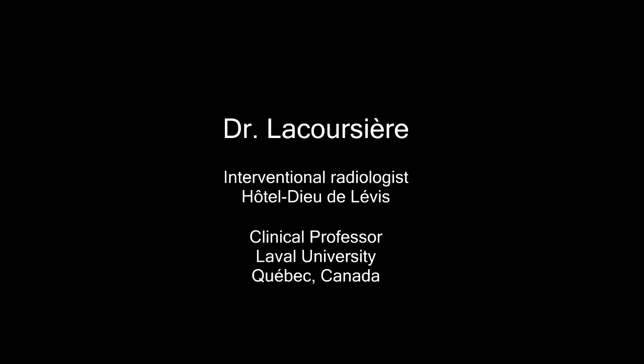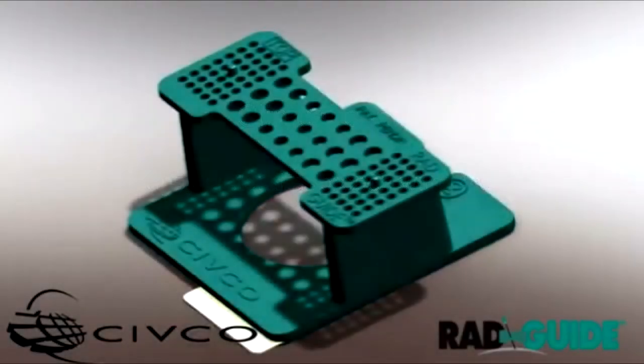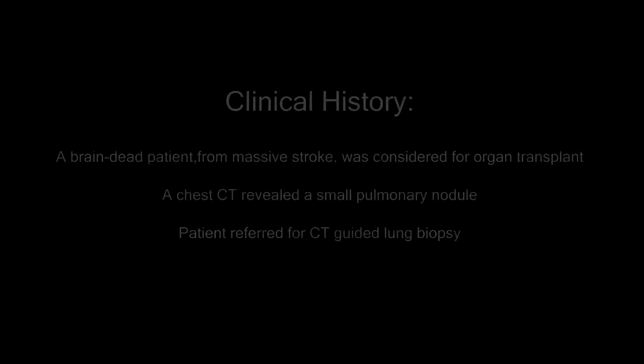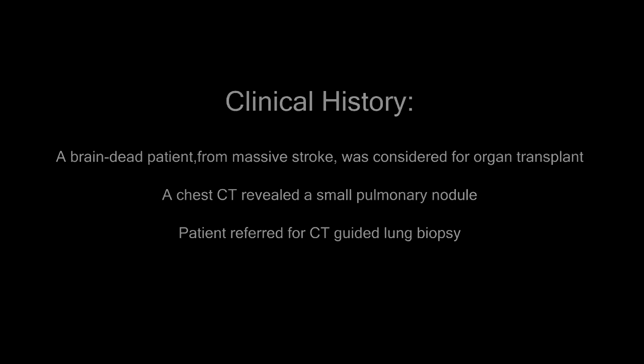I am Dr. Lacoursière, Interventional Radiologist, and I'm going to present you a clinical case of a lung biopsy using a lateral approach with the RAD-GUIDE. The patient here is a brain-dead patient from a massive stroke who was considered for organ transplant. A chest CT revealed a small pulmonary nodule, and so the patient was referred to us for a CT-guided lung biopsy of the nodule in order to exclude an underlying lung cancer.